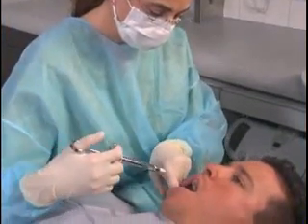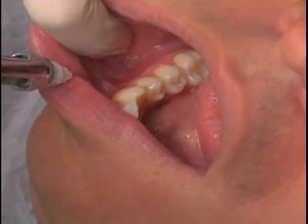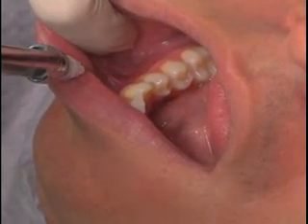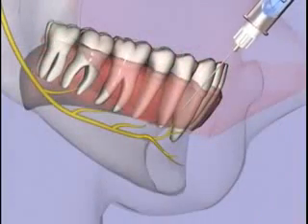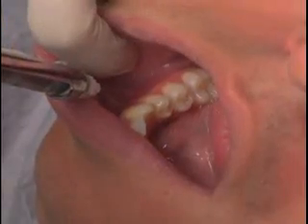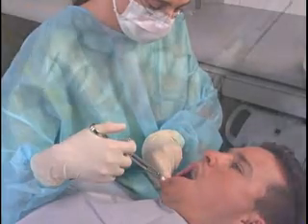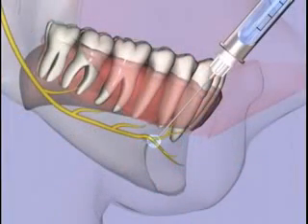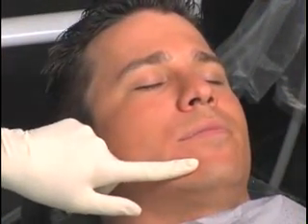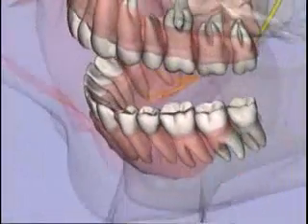For the right or left incisive nerve block, the barrel of the syringe is kept below the patient's line of sight, and the needle inserted into the buccal fold adjacent to the first premolar, and then advanced until the needle tip lies outside the mental foramen. Following 2 negative aspirations, 1/3 of a cartridge of anesthetic is deposited over 20 seconds. The syringe is removed and pressure is applied extraorally or intraorally, forcing local anesthetic into the mental foramen, blocking the incisive nerve.